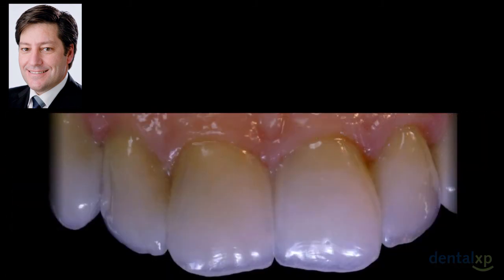And you can see here the final prosthetic work. I like this picture very much because you can appreciate how the surface texture was worked on the teeth and how differently it was addressed in the ceramic.